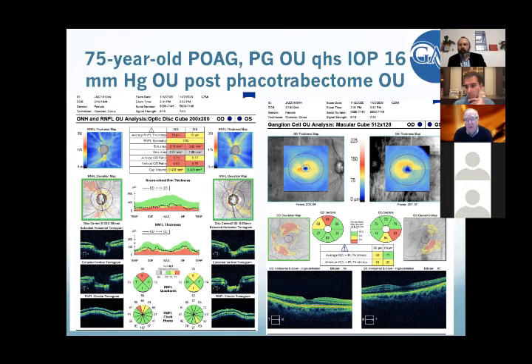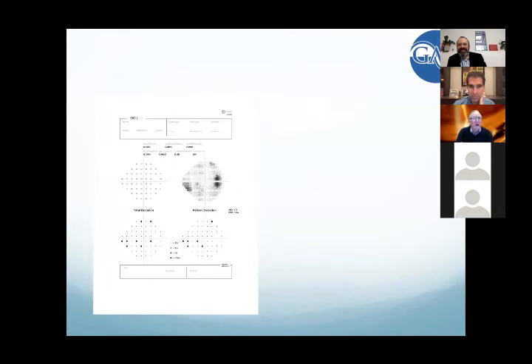And that also shows up, interestingly, in the ganglion cell, which you can see on the right side. And you can also see there's significant ganglion cell loss in the retina in areas that correspond to the nerve fiber distribution. So it actually occasionally makes sense in glaucoma, but not always, that's for sure. So that's what the nerve fiber looks like. So let's go to the next slide.